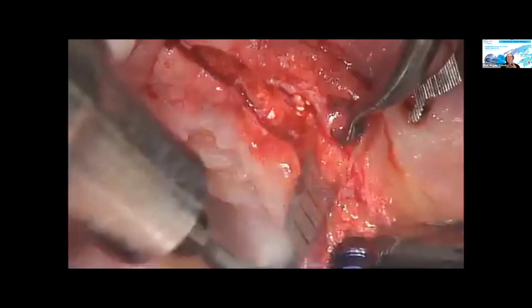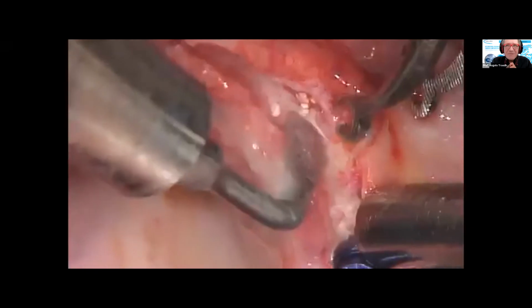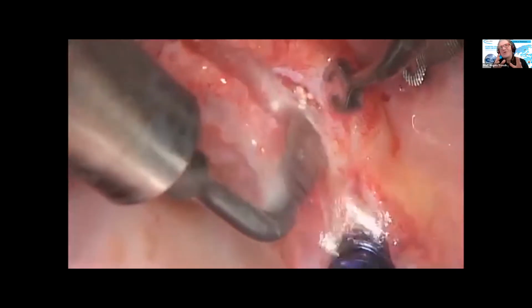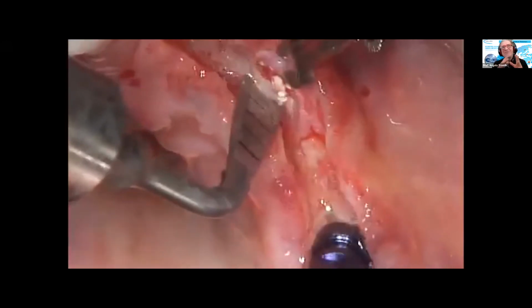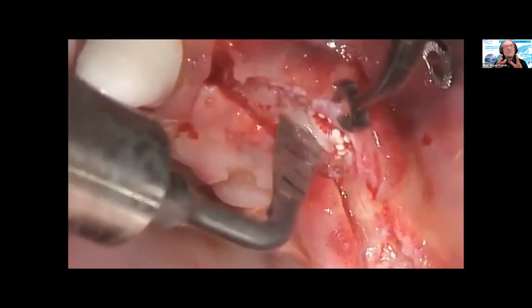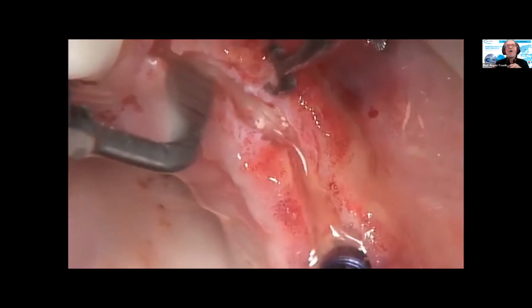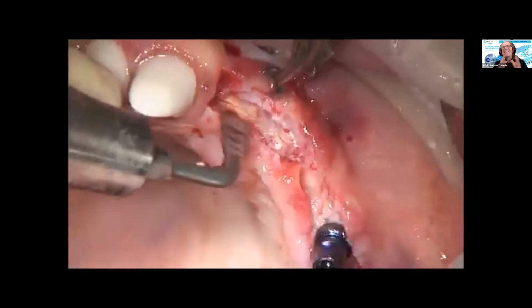So whatever we do with this bone, as long as it is attached to the periosteum, it's vital bone. This is also why I especially like this live surgery video, because this is another feature which you can only achieve with piezotomes. You can do osteotomies around a curve, because with rotary instruments, even with chisels, this is impossible.